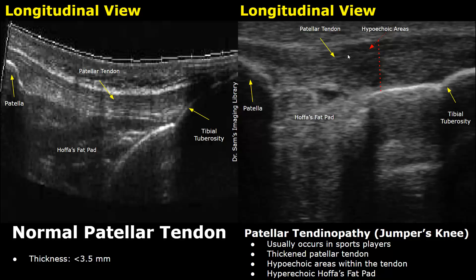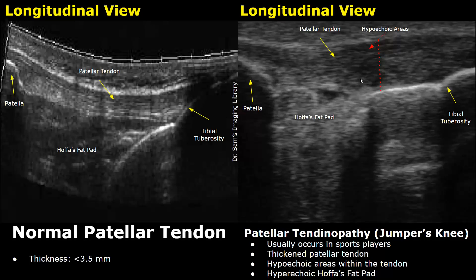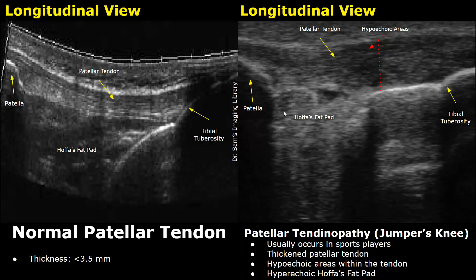These dark areas within the tendon — normally the tendon is hyperechoic, it is a bright structure — but here we have dark areas, which indicates degeneration of the tendon. Some areas will have tears as well; the tears will appear more hypoechoic or anechoic. The Hofas fat pad can appear hyperechoic in some cases due to inflammation, as compared to the normal image.